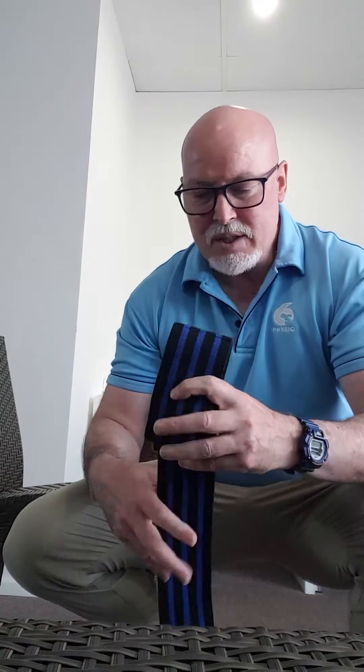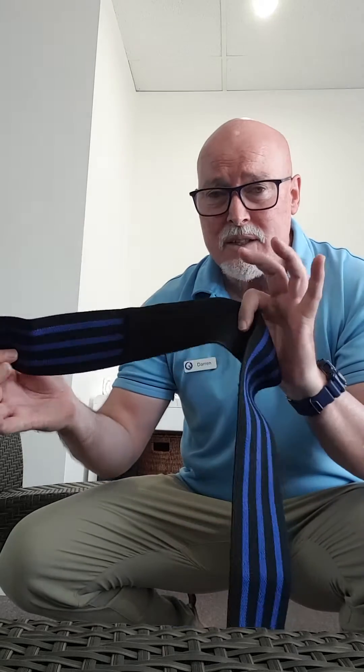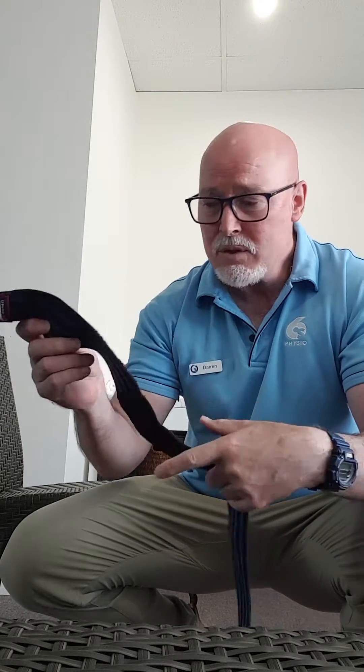I'm going to show you a couple little tricks on how to apply your blood flow restriction bands, which is your home-based option for blood flow restriction. In the clinic we use smart cuffs and air bands, but at home these knee wraps which powerlifters use are the best option for the lower limb — for leg stuff. We'll talk about upper limb another day.